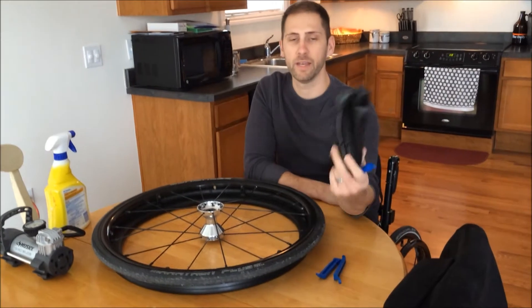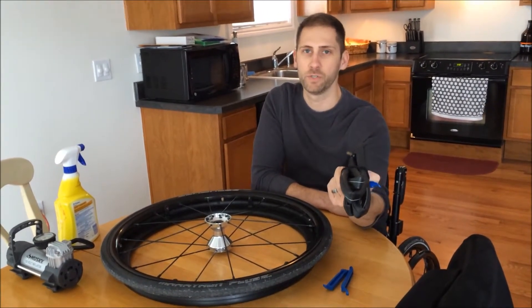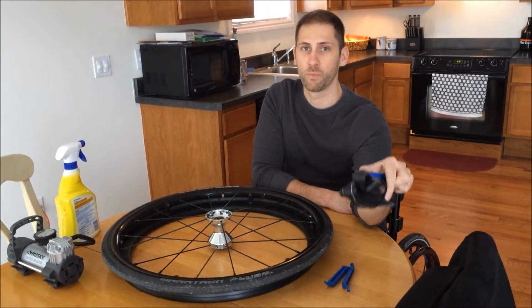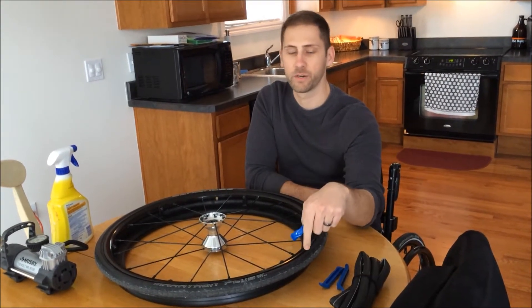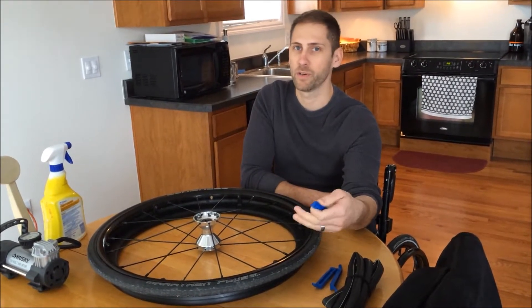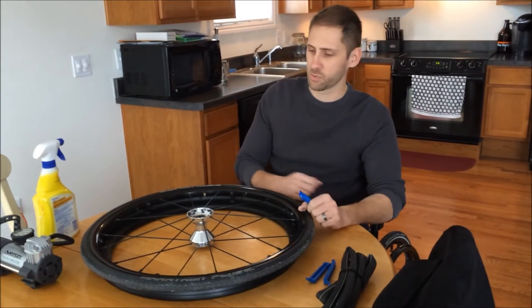Another thing you would want to get is just a spare inner tube. I always keep a spare inner tube just in case I ever have a flat tire. I think it's a little easier to just replace it with one that you know is not going to leak rather than trying to repair an inner tube that is punctured. Of course you can do that if you're in a tight squeeze, but I personally like to just replace it altogether.